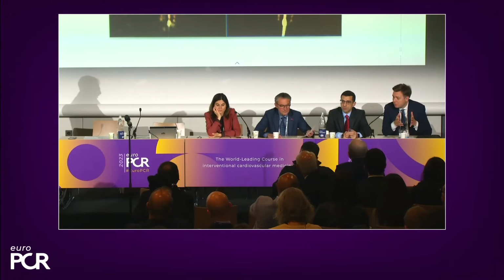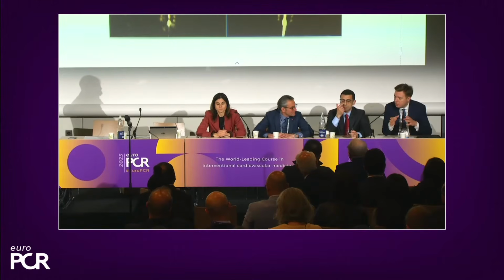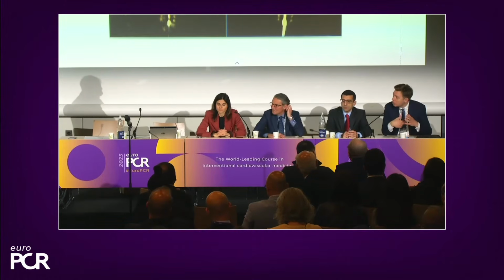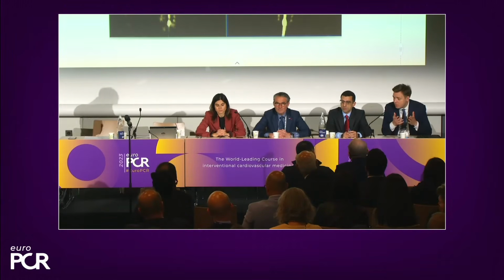That has always been a problem, because with intracoronary imaging, you need to do, for example, an OCT run, and then you do a 3D reconstruction with OCT, you're not correct, then you have to pull out the OCT, rewire again. So these kinds of technologies may allow us to more quickly get to the places we want with the wire. And then, of course, in some of the techniques, positioning of the stents needs to be really meticulous. And with these kinds of possibilities, I think that could help us.